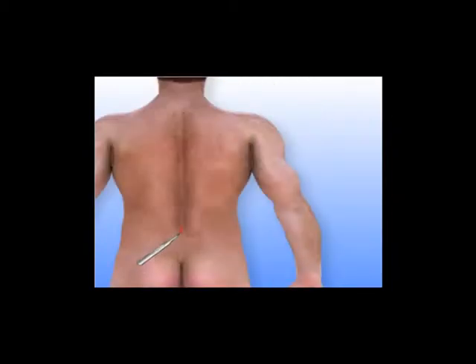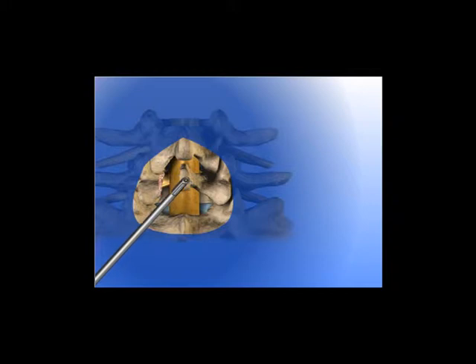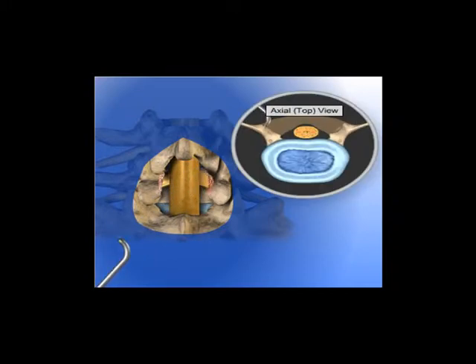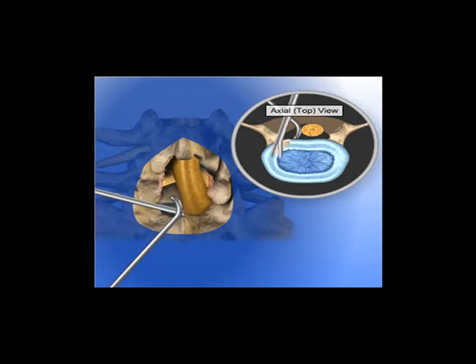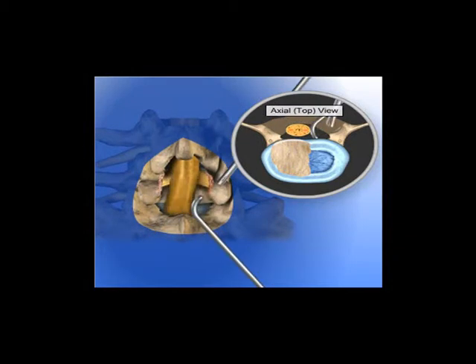An incision is made in the middle of the low back. The muscles are moved aside and the lamina portion of the vertebrae are exposed. Cutting instruments are used to remove the spinous process, portions of the lamina, and portions of the facet joints from the back of the vertebrae. Removing bone here allows the surgeon to see the disc and compressed spinal nerves. A grasping instrument is used to remove most of the intervertebral disc, which relieves pressure on the compressed spinal nerve, allowing it to return to the proper position.